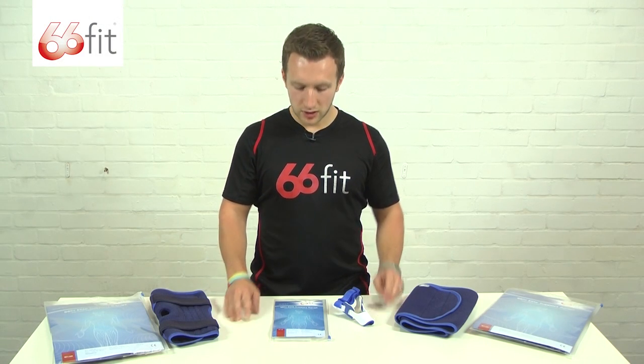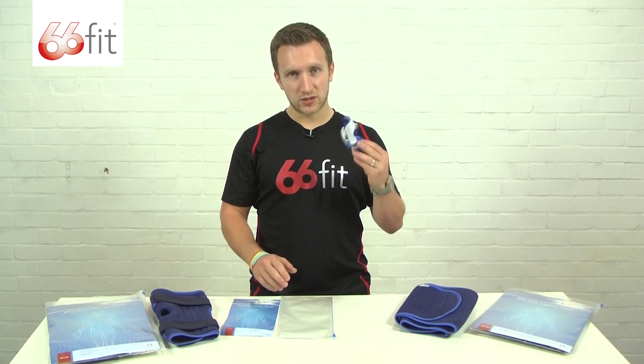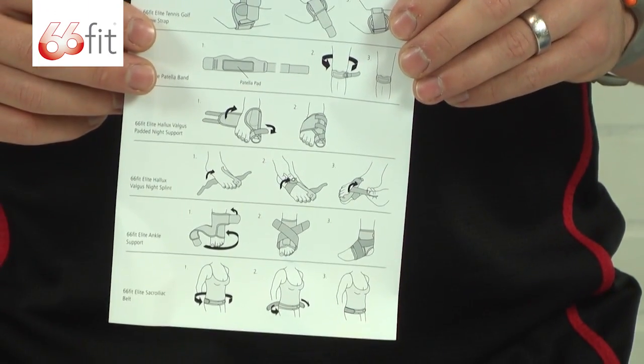This is a selection of the 66 Fit Elite range of supports. They all come packaged in a durable ziplock bag, and inside you get your support as well as an instruction card. On the front you've got an anatomical drawing, and on the back you've got various fitting instructions for whichever support you've purchased.